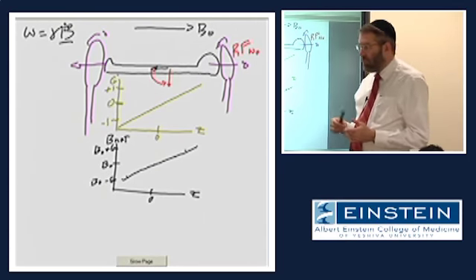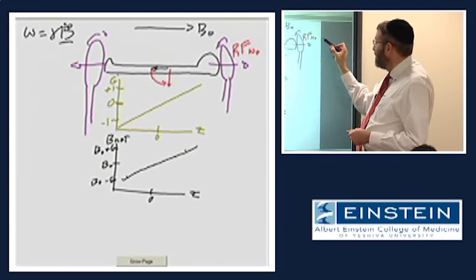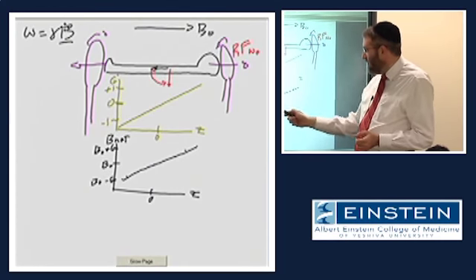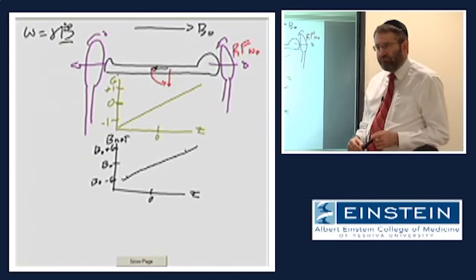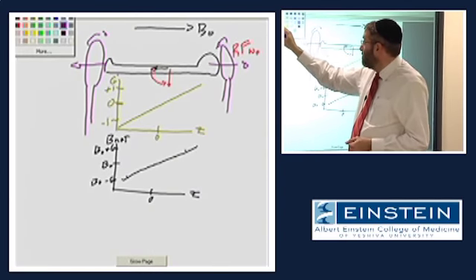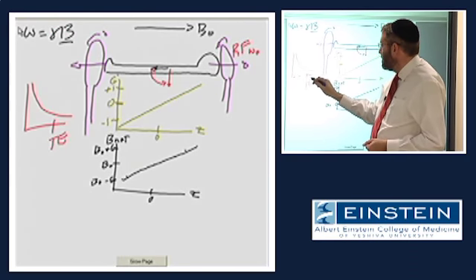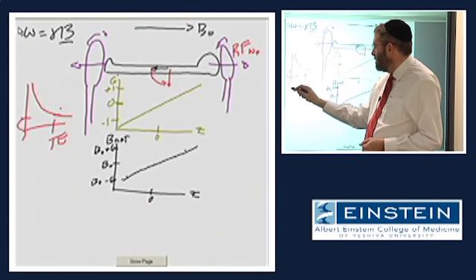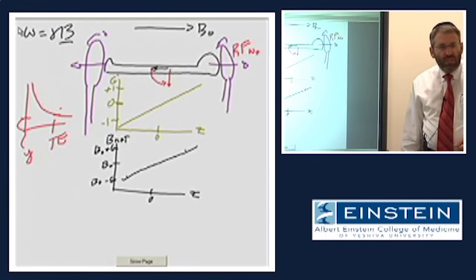Okay. So if we do the same thing again, turn on our RF at omega naught to rotate this magnetization, but we do it in the presence of this gradient magnetic field, what happens? Well, we do that, and we generate some signal, right? And then at TE, we measure that signal. So my real question is the signal amplitude that we measure at TE, however many units of signal amplitude, where does that come from? Where is that signal arising from?